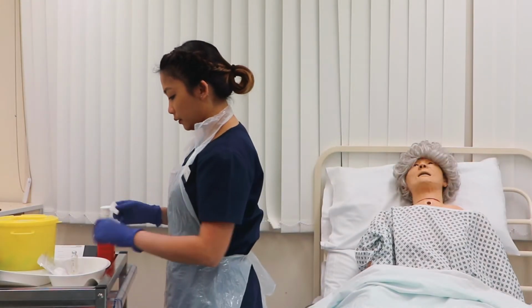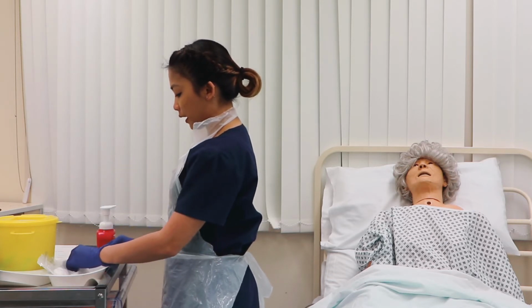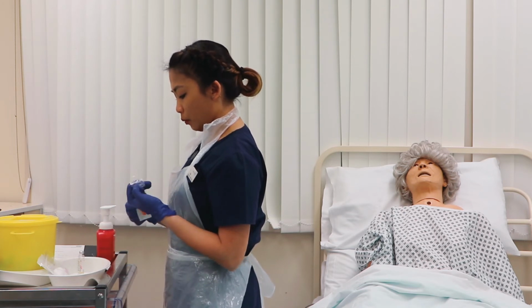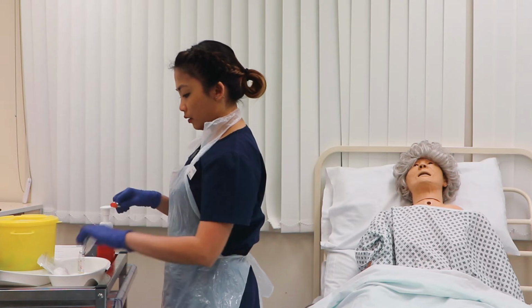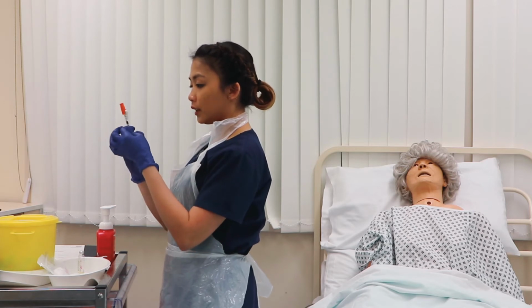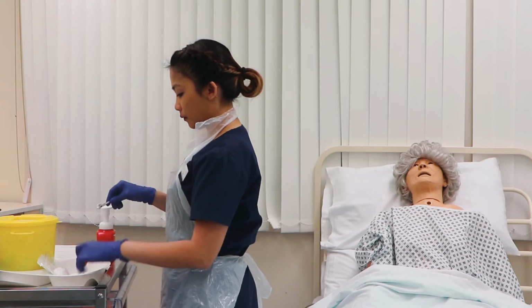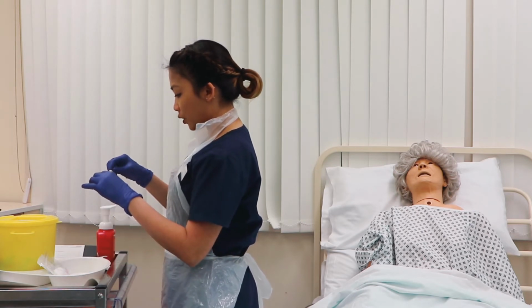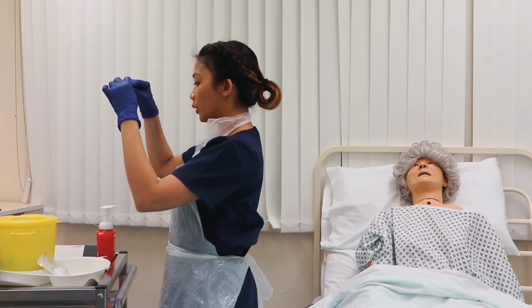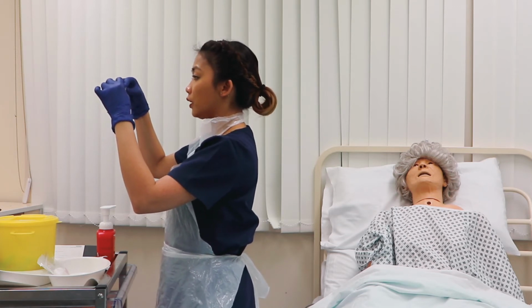I will clean the vial, giving it a good clean and letting it dry for 30 seconds. I'm going to open my syringe. Check for functionality. I'm going to withdraw my medication at eye level and bevel up. I'm going to withdraw 14 units of glargine according to the prescription.